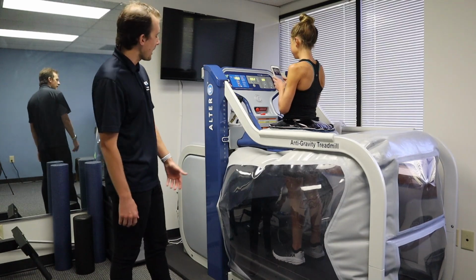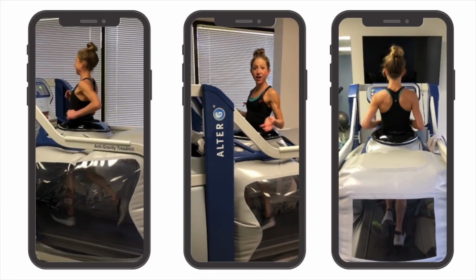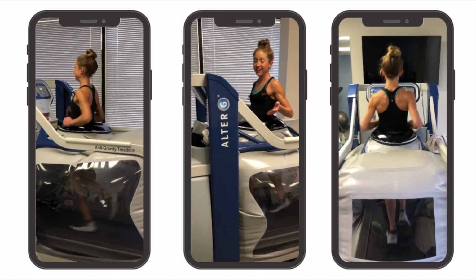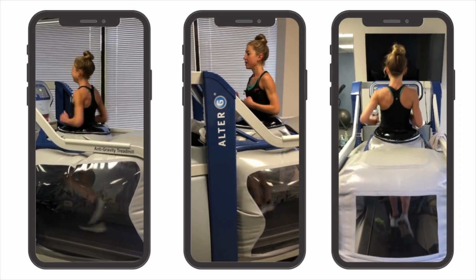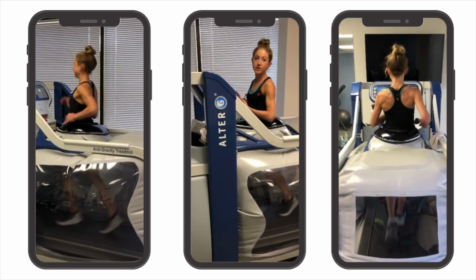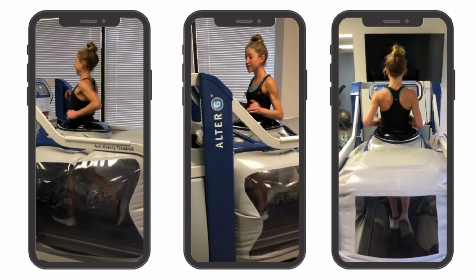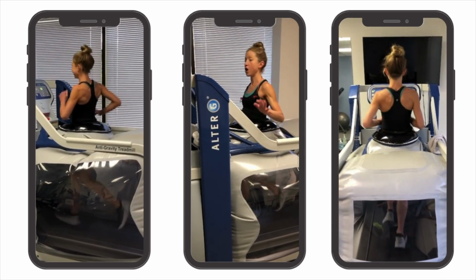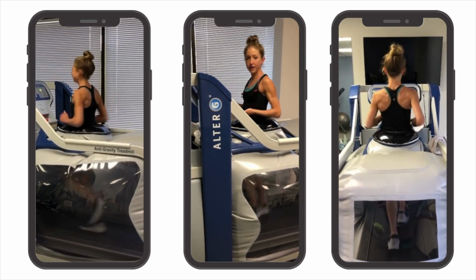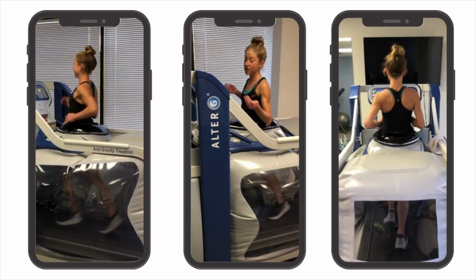20 to 30 seconds have gone by now. Calibration's done. The fun is ready to start. So I just completed a run on the AlterG, and I was at 70% just for like a smooth ride. It felt so good. I currently don't have any injuries, but I don't run consistently outdoors. It's something I used to do all the time when I lived in San Francisco. But then I had a sesamoid injury, and I stopped running for 4 to 5 years. So returning to running was very jarring for my body because it really wasn't used to walking or running. So I used things like the AlterG to slowly acclimate to the movement pattern again because it was so foreign to me after taking so long off with my sesamoid injury.